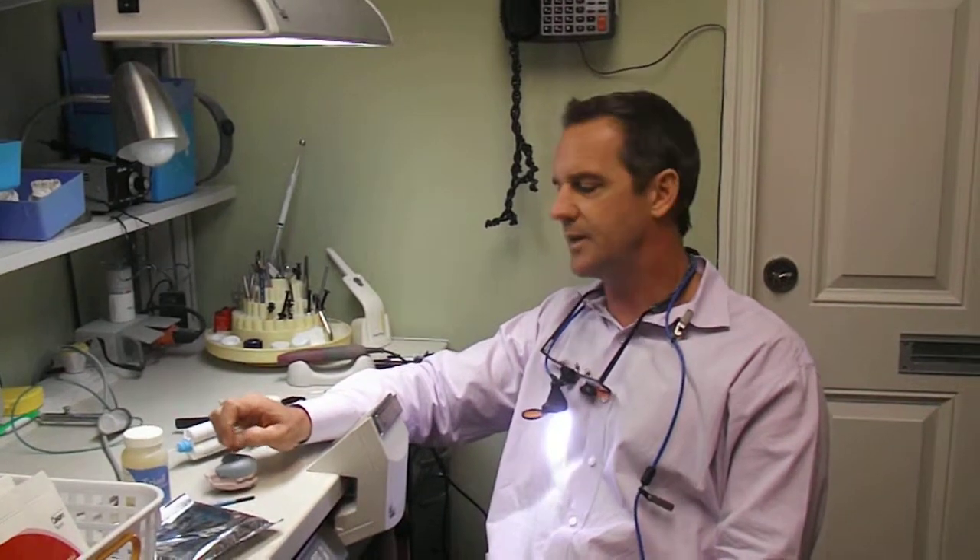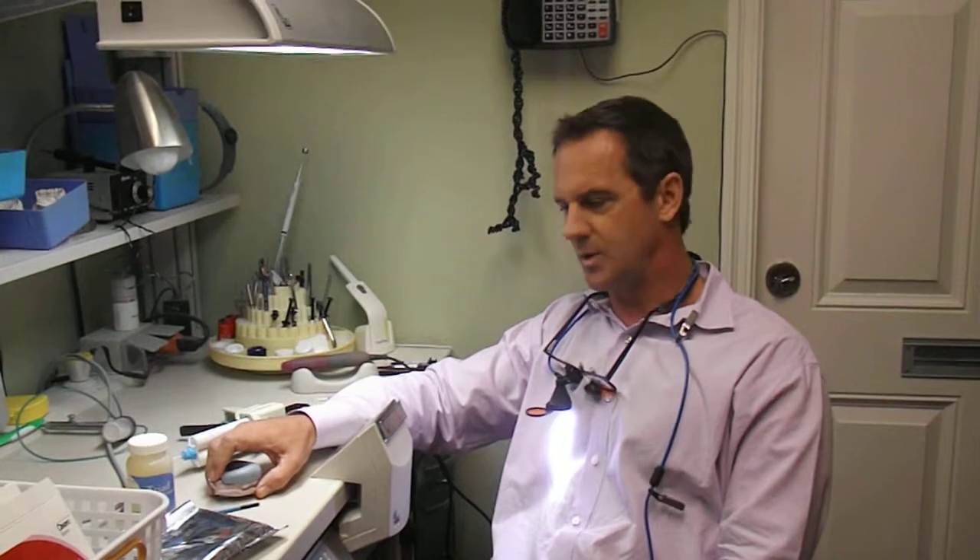Hi, I'm Johnson Haygood with the FACD Tip of the Month for March 2014. Today I'm doing an indirect provisional for eight upper anterior restorations.